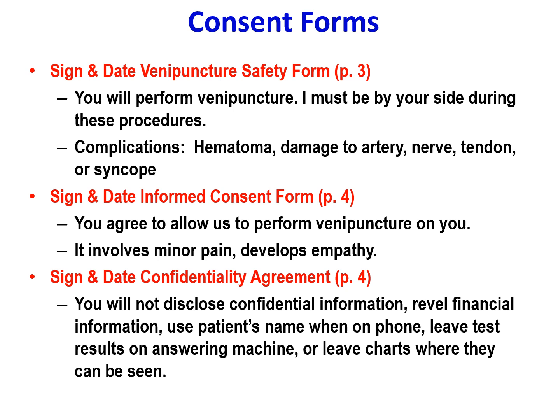We will go over the consent forms. You will have to sign and date your venipuncture safety form. You will perform venipuncture. I will be by your side during the entire procedure, but there are complications dealing with venipuncture, such as hematomas, the ability to damage an artery, a nerve, or a tendon, and syncope, which is when you feel as though you may faint.